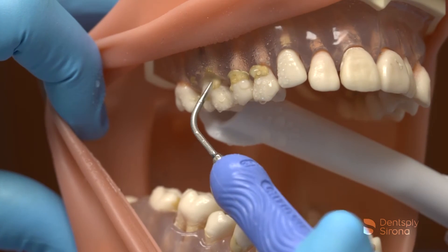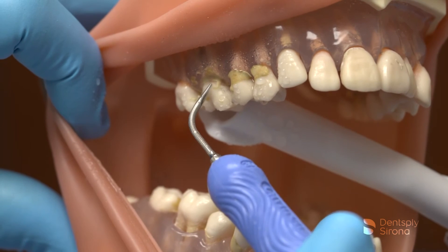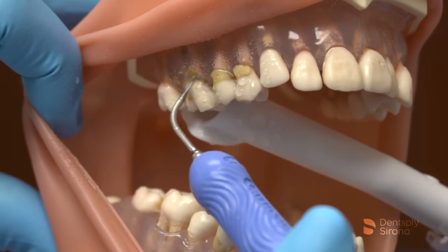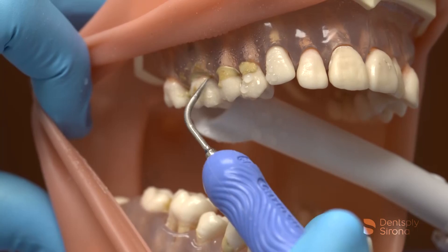These steps should be repeated in a methodical, channel fashion, ensuring complete removal and thorough biofilm disruption.